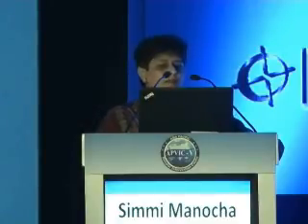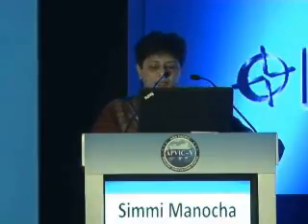Other controls are image optimization controls, which can automatically attempt to adjust the gain appropriately throughout the image. There is a zoom view which allows magnification. There is a focus which optimizes the lateral resolution at a given depth.